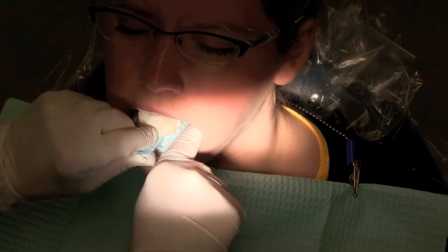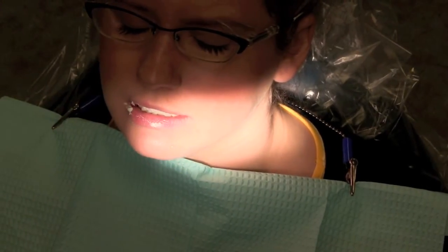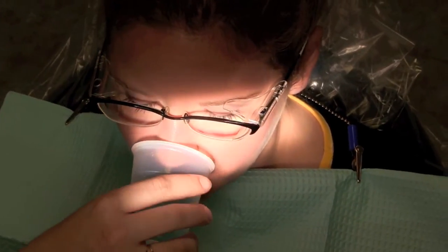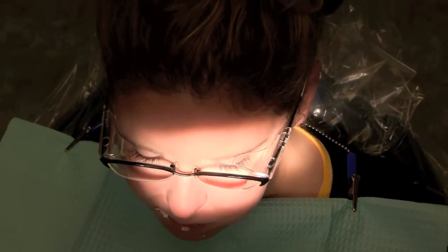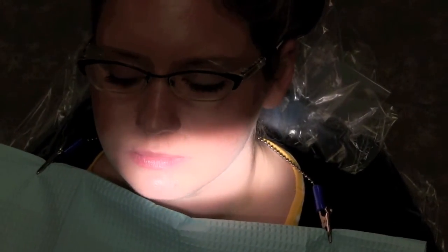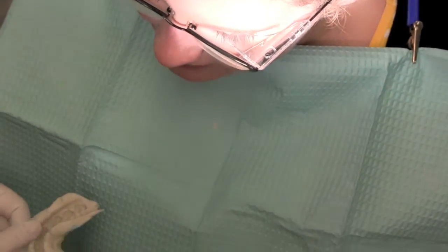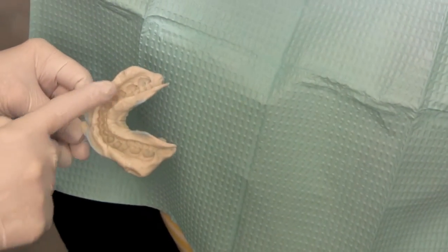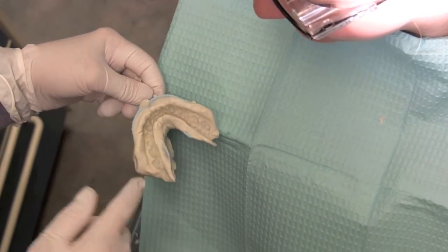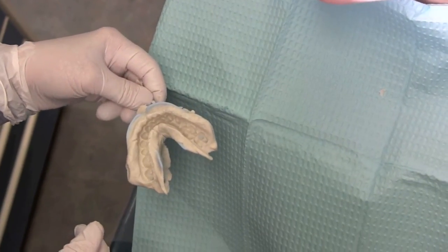I'm going to remove it, and Derek is going to have you rinse with some Listerine. Katie, I just wanted to show you that the impression turned out perfect. We have a beautiful periphery of your lips and the outer structures of your mouth, and all the teeth are just perfect in the arch. So this is a very good impression.